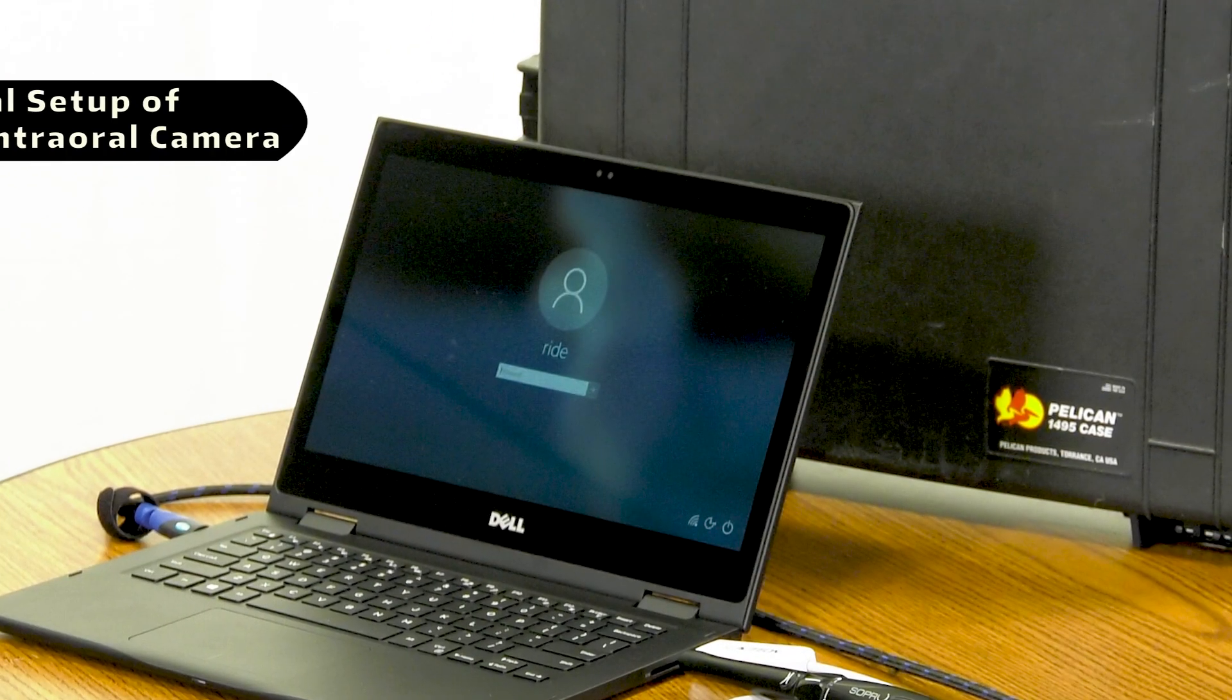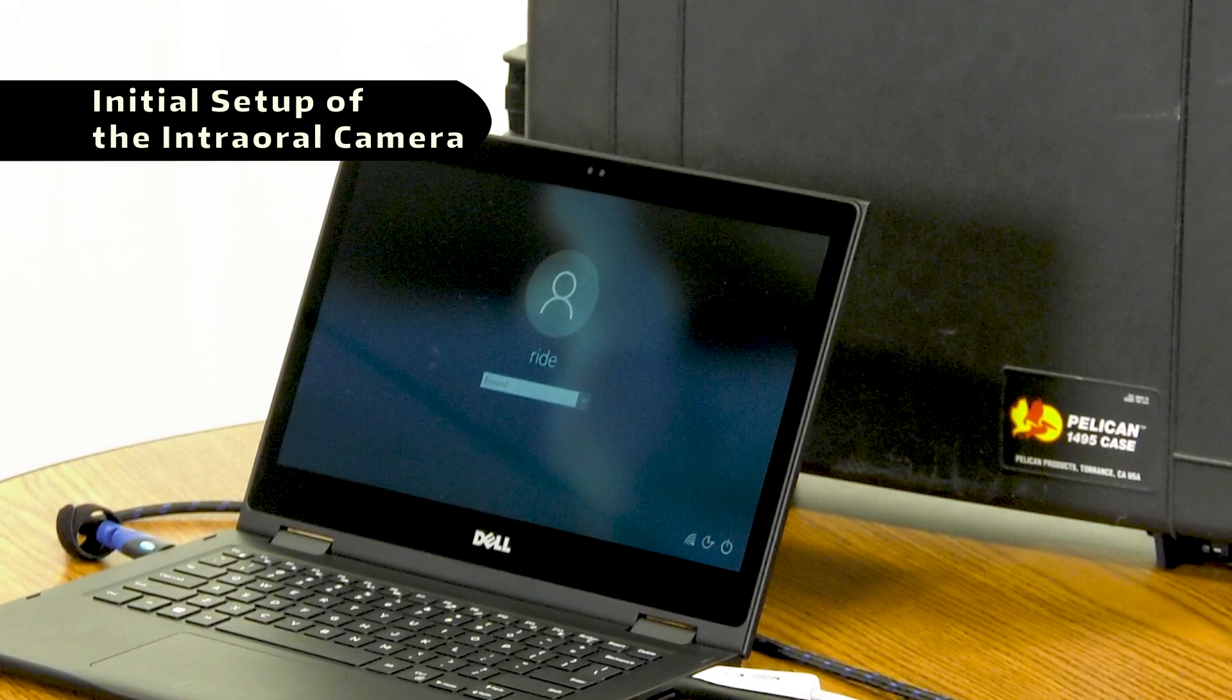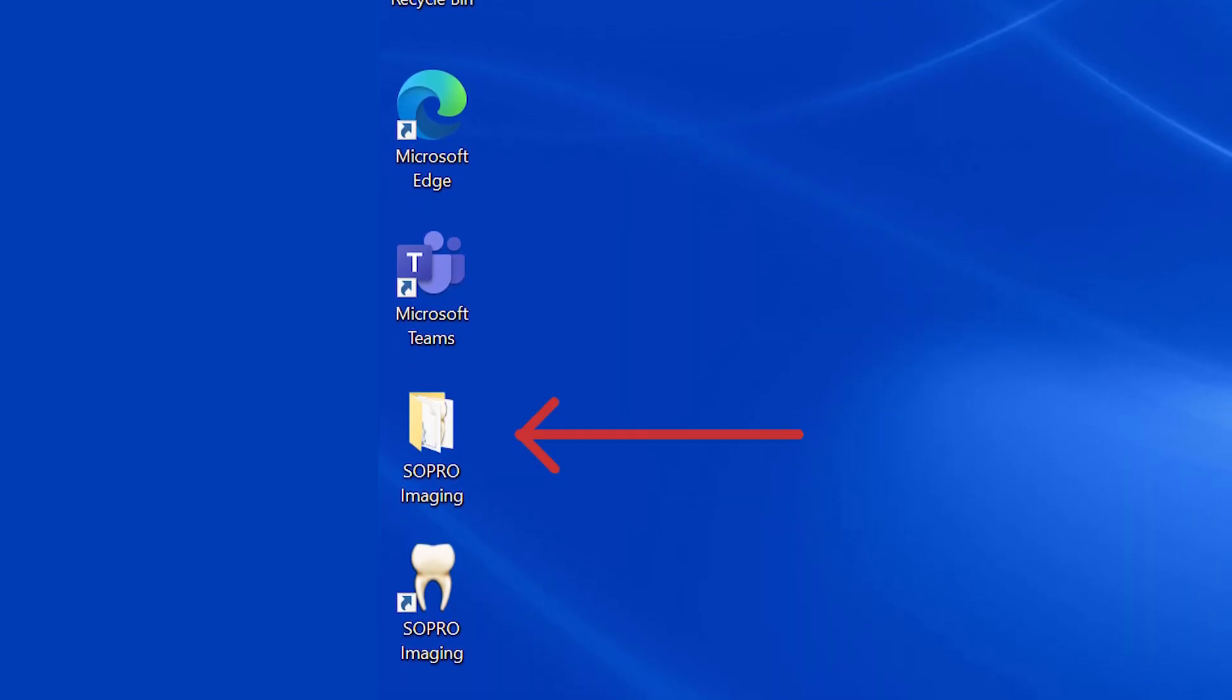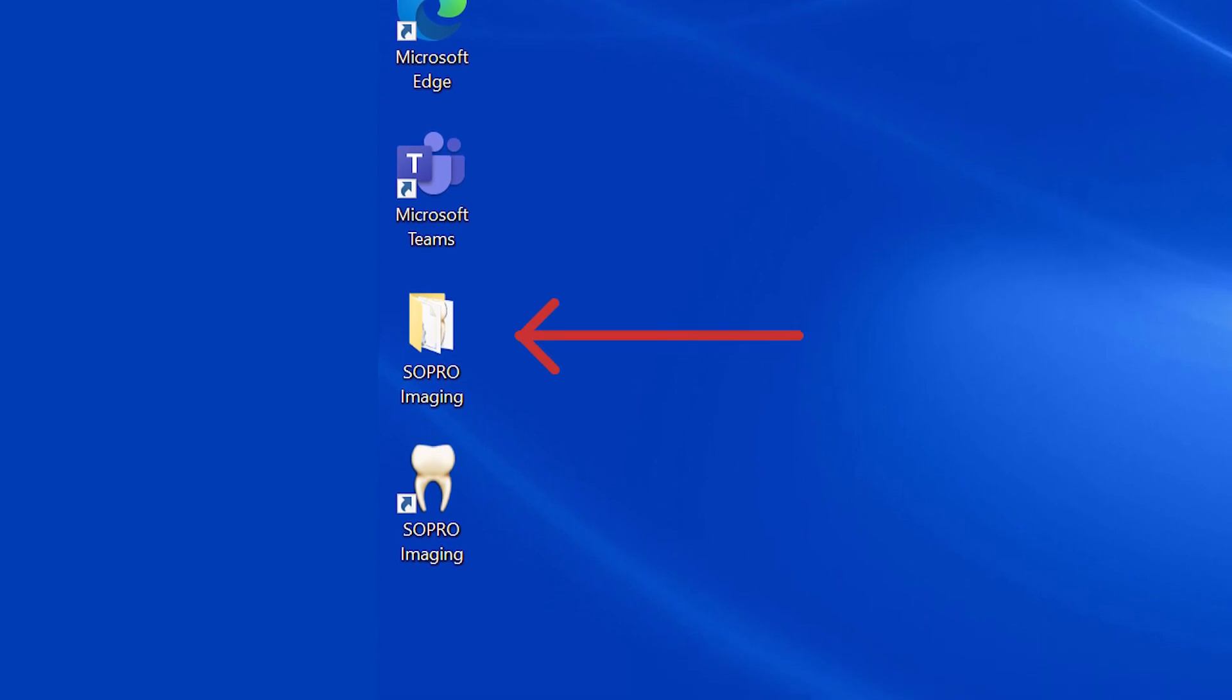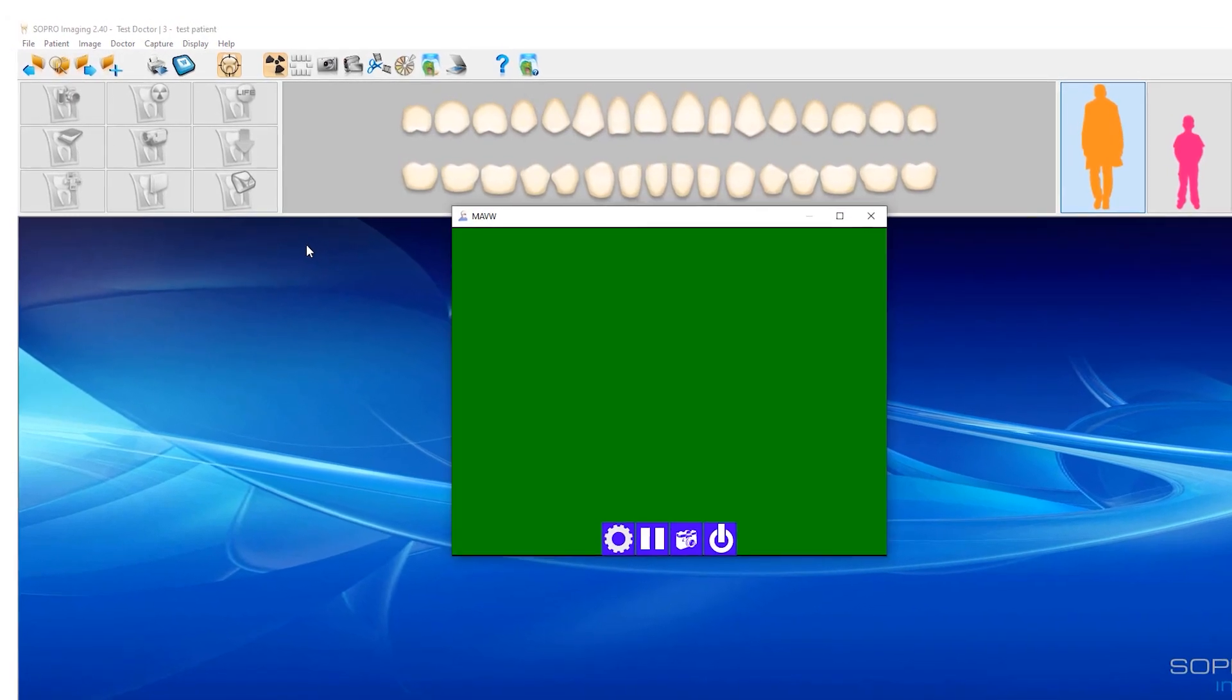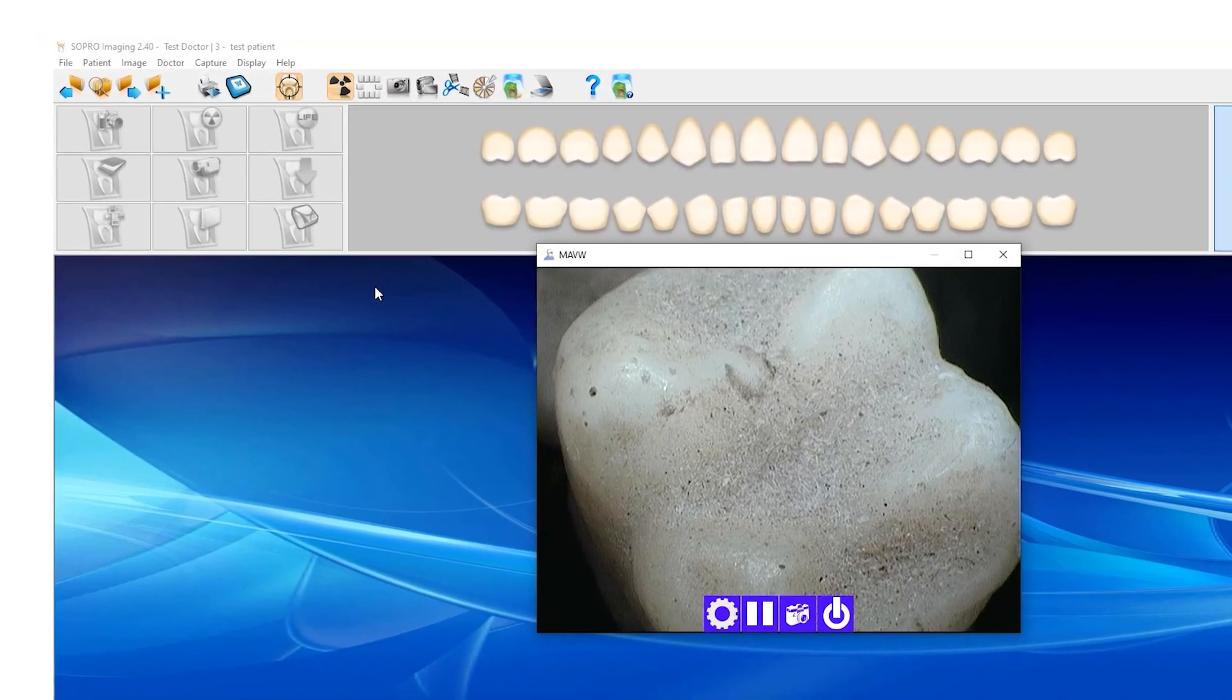A CD copy of the SoPro imaging software was included in the Pelican carrying case along with the laptop. By default, the installation files within the CD have been placed on the desktop of the laptop. The SoPro imaging software allows users to capture and record intraoral images with the diagnostic camera. It must be run first before using the camera.